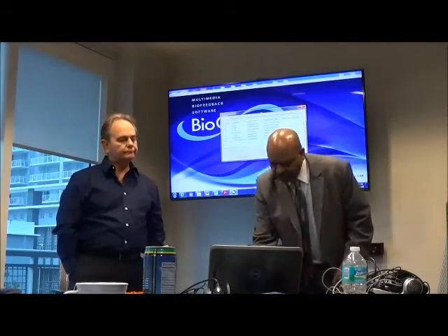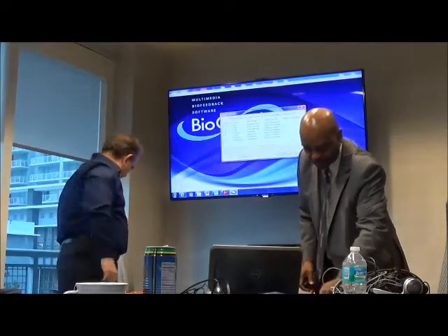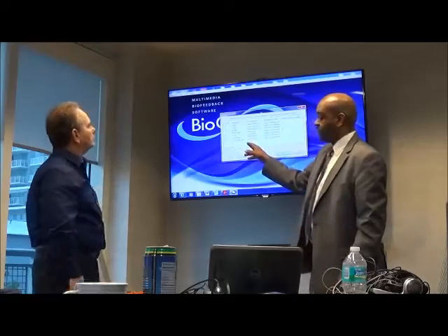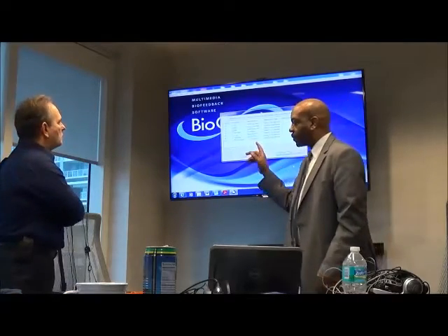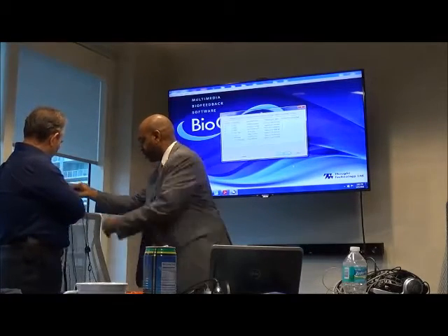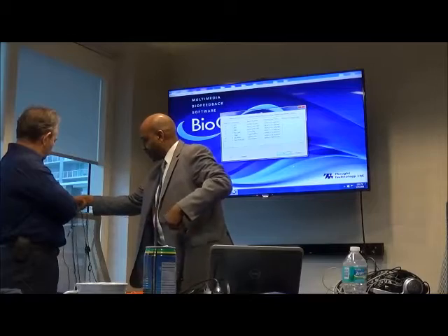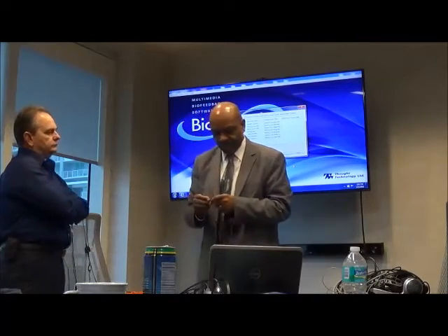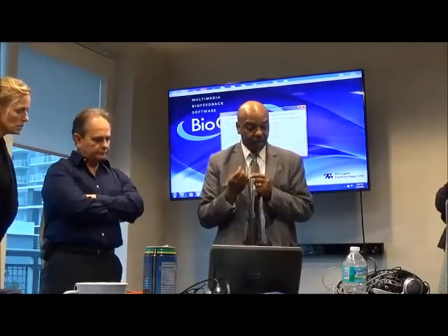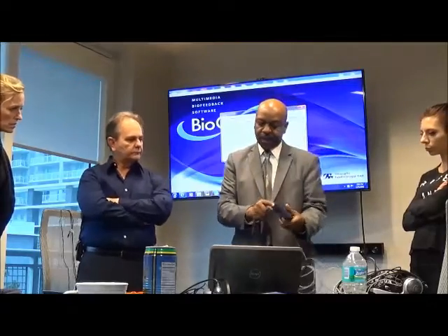Okay, so now we can go ahead and start doing the placements. On this screen, it's showing where the sensors need to be plugged in. One thing on this equipment that's important is when you're plugging a sensor in, the end of the cable has a white arrow on it, and where that plugs into the instrument, there's a dot.